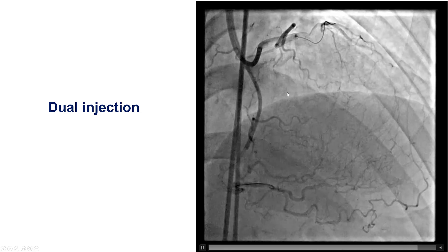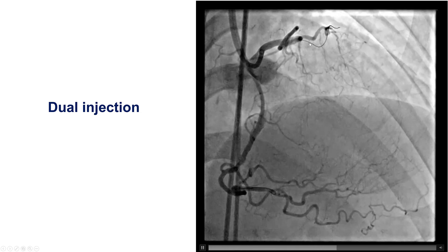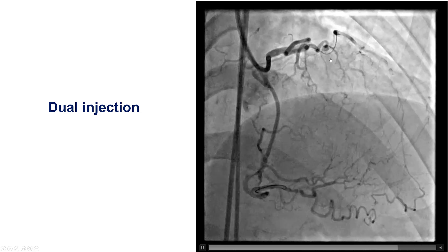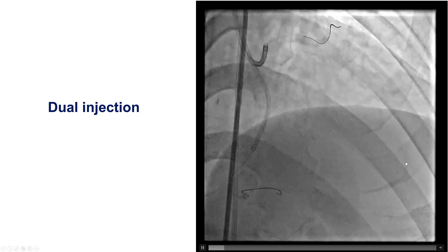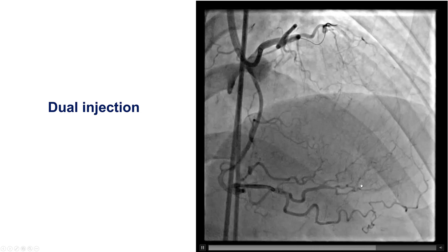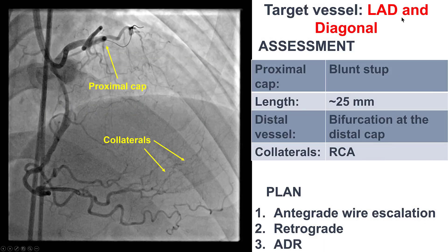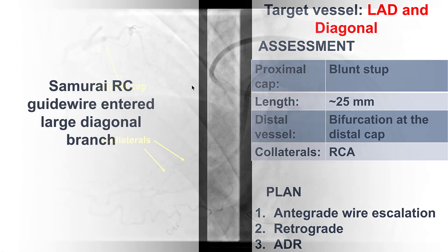This is a dual injection. The patient has a proximal LAD with an ambiguous cap. There is a diffusely diseased distal vessel. The length is about 25-30 millimeters. There are septal collaterals from the PDA filling the vessel. The plan was to start with antegrade wiring to clarify the ambiguity, followed by retrograde through the septal collaterals, with ADR as the last option because there was a large diagonal branch.